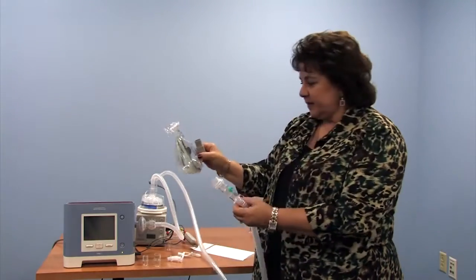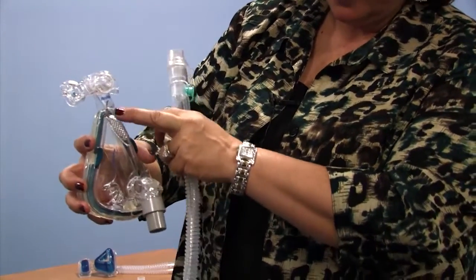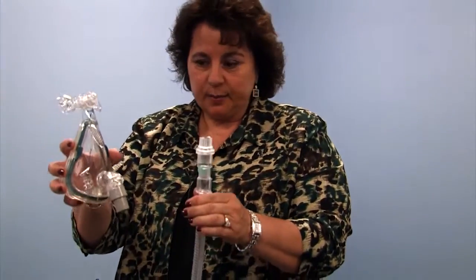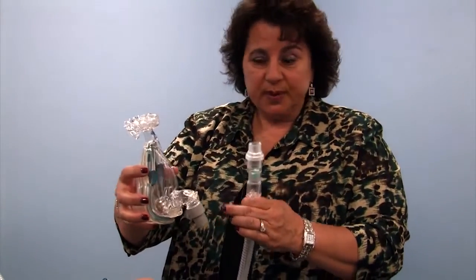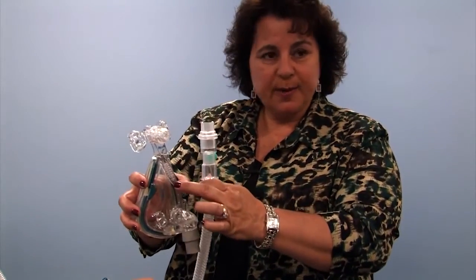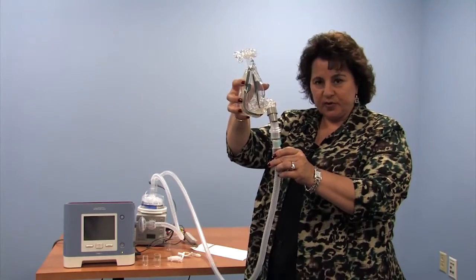If the mask for home use has a place where air vents out, it should be known as a vented mask with an exhalation port of some sort in it. We only need one place for the patient to exhale carbon dioxide. The preference would be that it be in the mask. So these little star type holes that you see here, this is where the air would come out for this patient. We would be able to directly hook up the mask to the hose. We would not need a secondary whisper swivel.